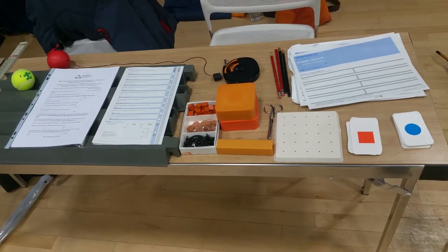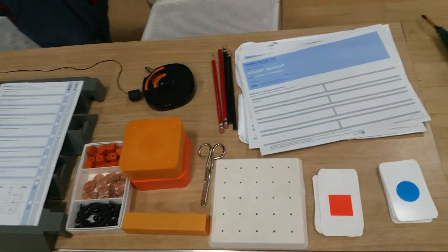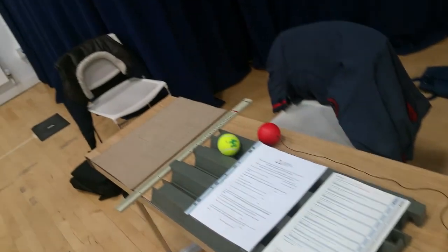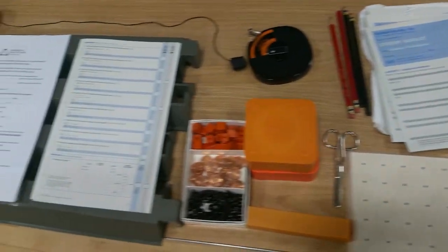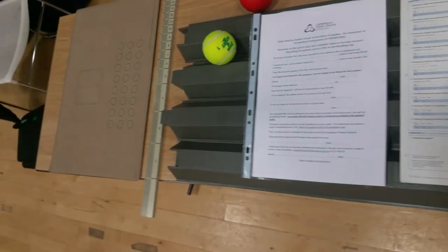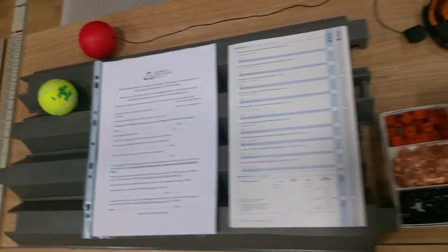Welcome to Group 2's presentation on the Bruininks-Oseretsky test of motor proficiency. Designed to measure motor proficiency in children from the age of 4.5 to 14.5, it was published in 1978. Although simple in implementation, the instructions and set-up we found to be quite complicated. The set comes with an array of equipment to measure both gross and fine motor skills, as you can see.